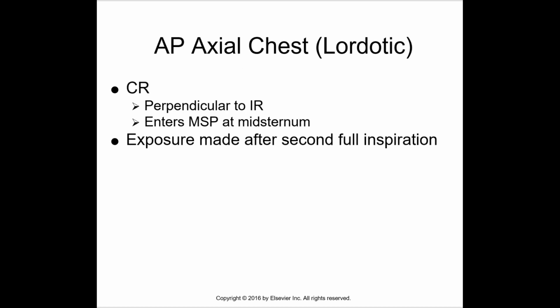Continuing, the CR is perpendicular to the IR. Enters the MSP at the mid-sternum, and again the exposure is made after the second full inspiration.